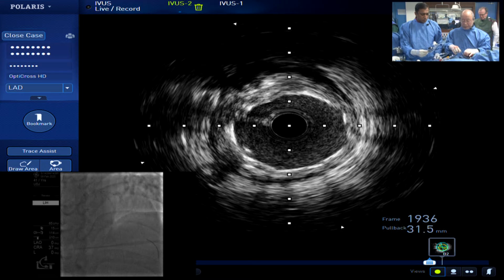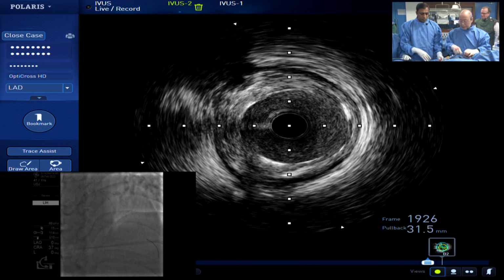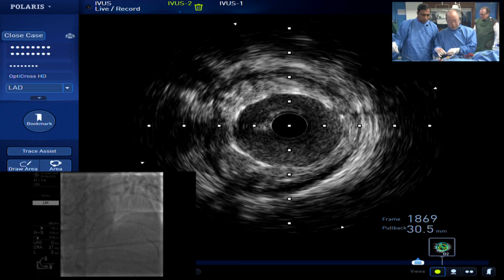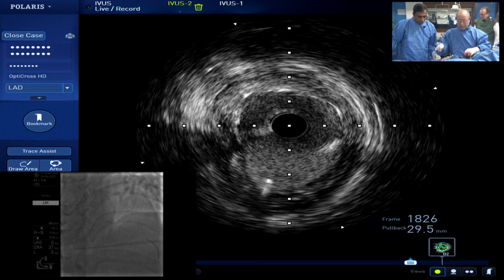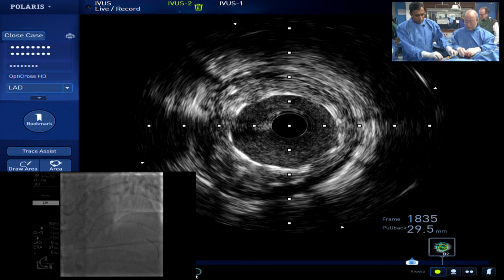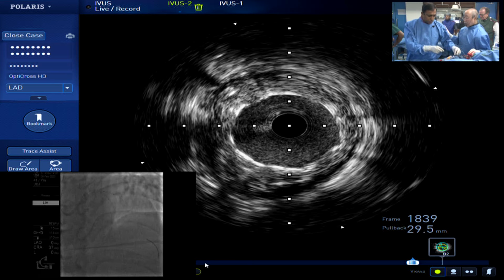Or in our institution, we try to use a Crusade double lumen catheter. I'm not sure if you have it here or not. It's very useful because there are two markers within 5 millimeters. If we push the double lumen catheter into the diagonal branch, we can identify the two markers and then pull back a little bit and try to insert the wire through the double lumen and select the diagonal. And then if you push in, it might be difficult to cross the two markers to the diagonal. That means one overhanging wire, the stent strut.